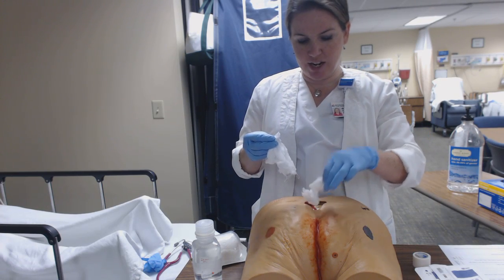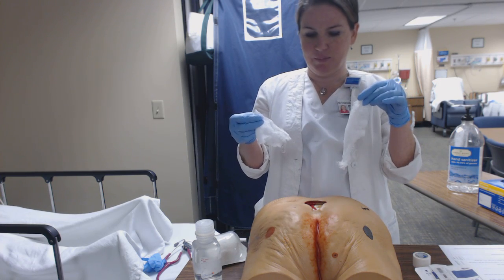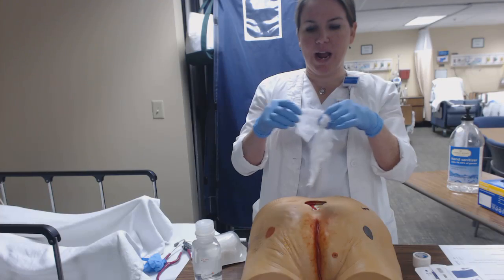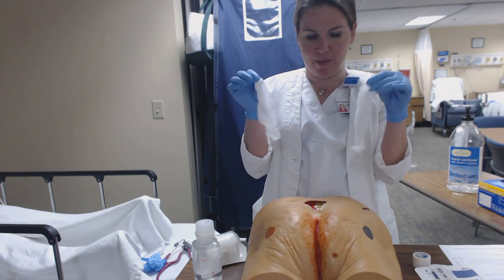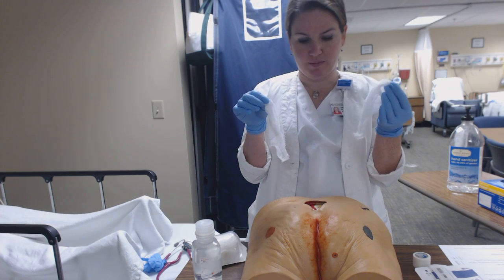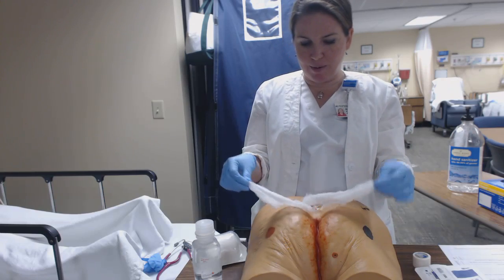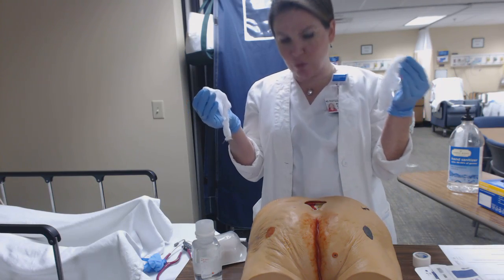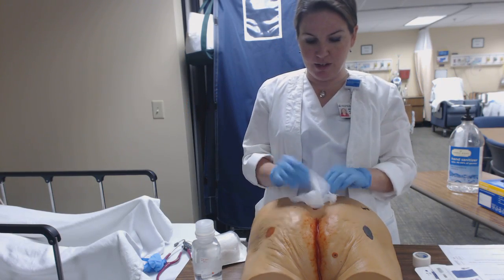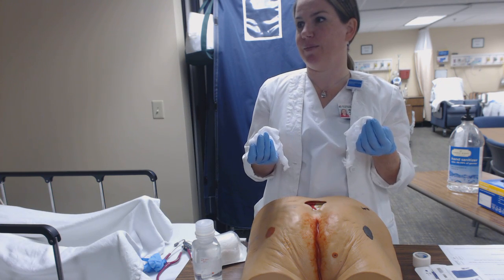Oh my goodness, what is this, Miss Palmer? I don't know who did that prior. Why would this be a problem in packing a wound? I don't know. It looks okay. It looks clean. It does? Mm-hmm. I don't think so. What would be the problem of having 2 or 3 or 4 or 5 different pieces of gauze in a wound that we're just stuffing in there?